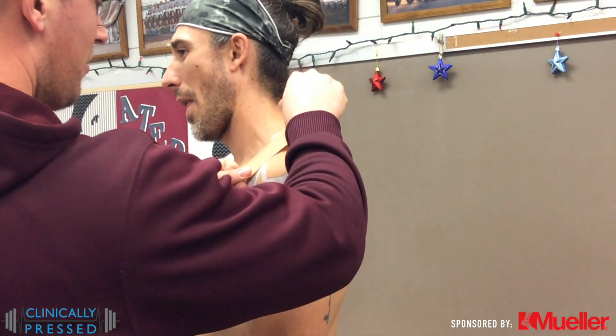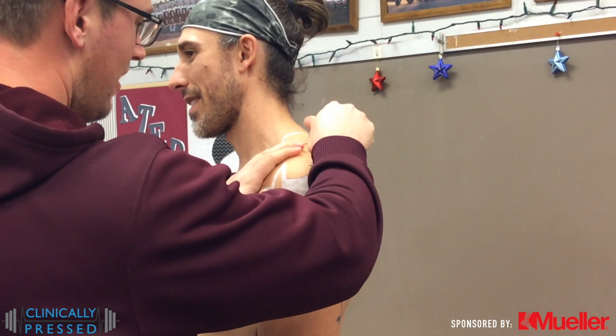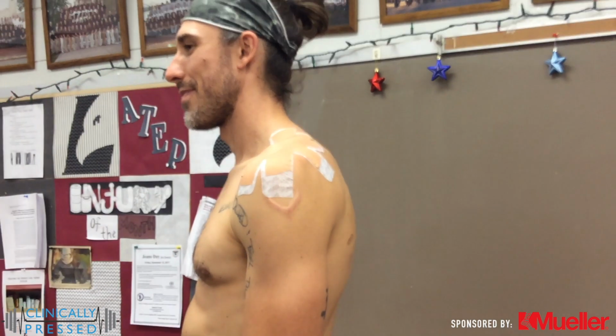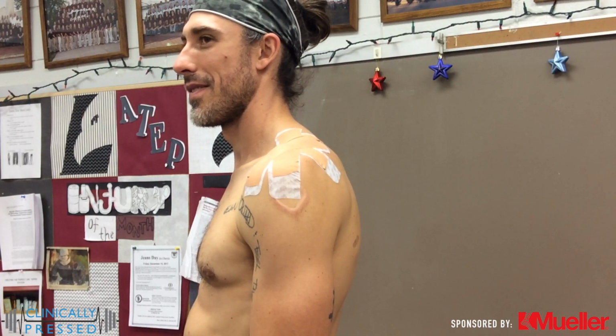That is something that can be customized. It may work a little bit, as you see with that one. I want a little bit more A to P, but it really is up to your athlete.